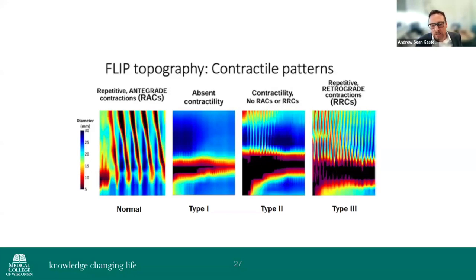If you fall into some of these other categories, some of them are a little difficult to tell exactly what the motility issue is, and you may need to move on to high-resolution manometry. But there are some pretty slam-dunk ones where you can diagnose achalasia. Not all of them will be slam dunks where you're really confident that it's achalasia.